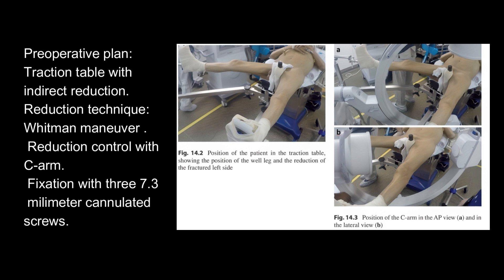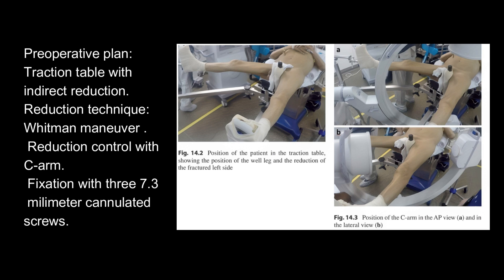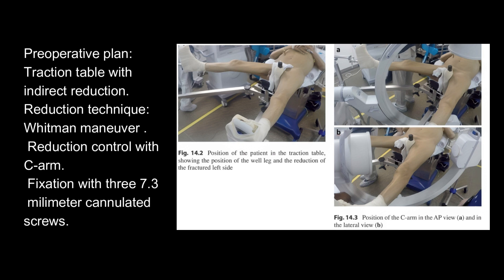Preoperative Plan: Traction table with indirect reduction. Reduction technique: Whitman Maneuver. Reduction control with C-Arm. Fixation with three 7.3 mm cannulated screws.